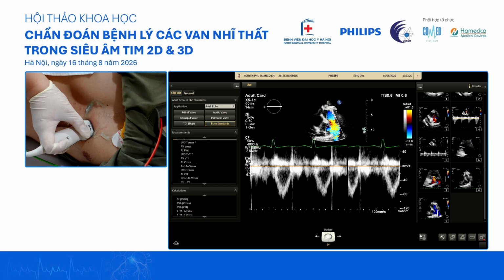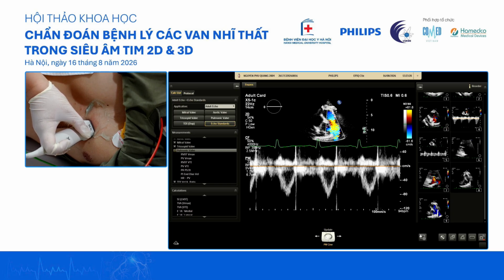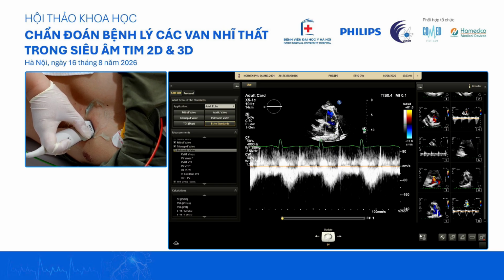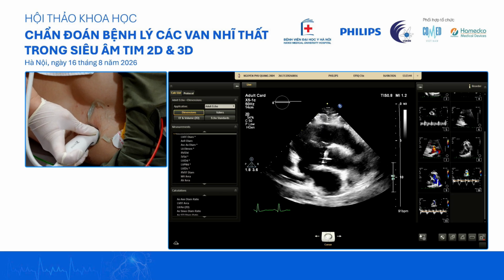Để tín hiệu Doppler xung qua động mạch phổi. So we do a pulse wave at this. We do a pulse wave at the RVOT as well as a continuous wave. So actually we can measure the Doppler slope. Chúng ta đo Doppler xung và Doppler liên tục qua đường ra thất phải.